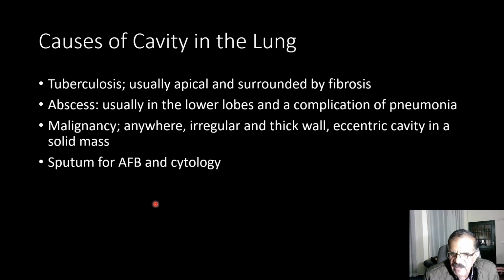Sputum for AFB and cytology is very important because, as I said, X-rays only show the opacity. There may be a very high index of suspicion of tuberculosis, and this X-ray may be diagnosed, but the definitive diagnosis of tuberculosis would require sputum for AFB, and definitive diagnosis of malignancy would require sputum for cytology or maybe bronchoscopy and biopsy.